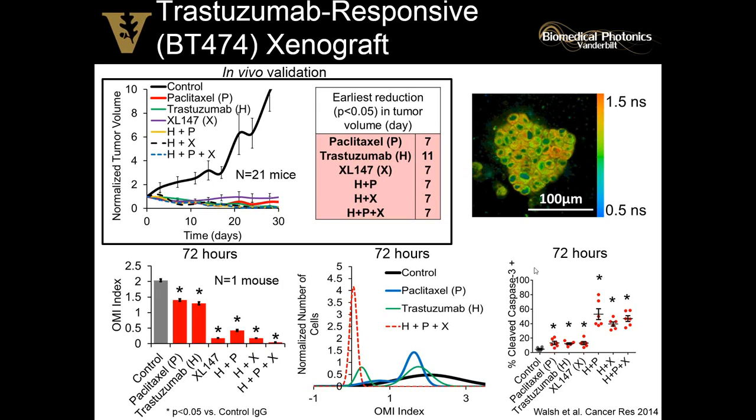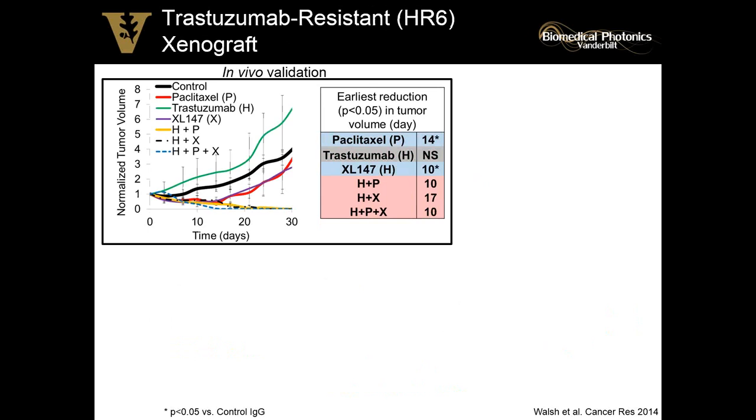We also validated with standard immunohistochemistry. This is cleaved caspase-3, which is a measure of apoptosis. And we also find that there is increased levels of apoptosis in all of the treated experimental groups.